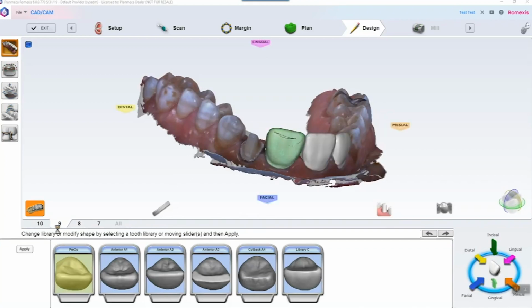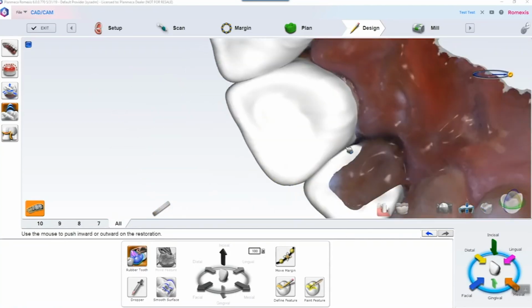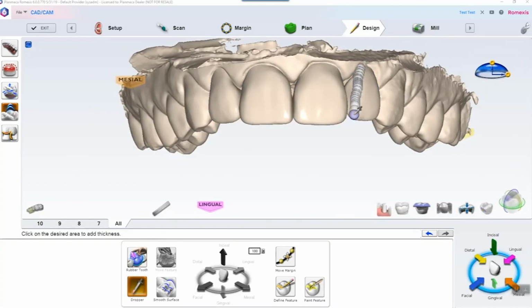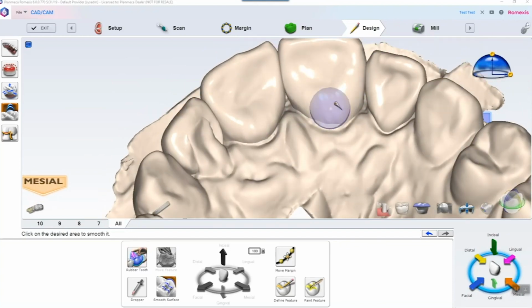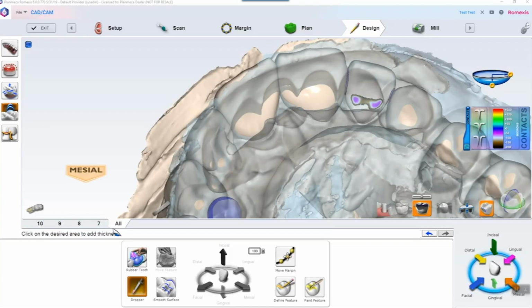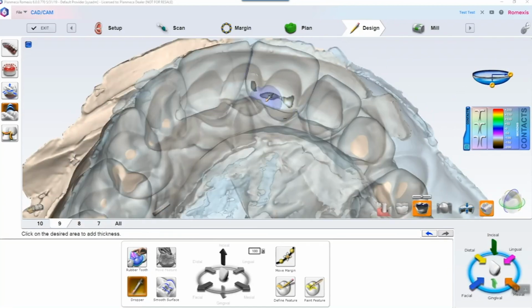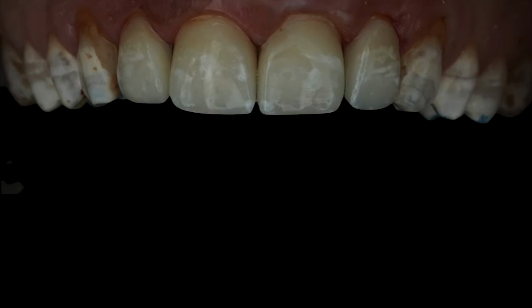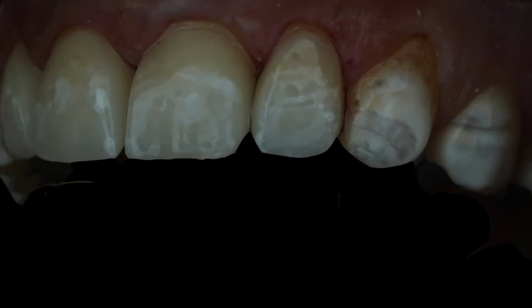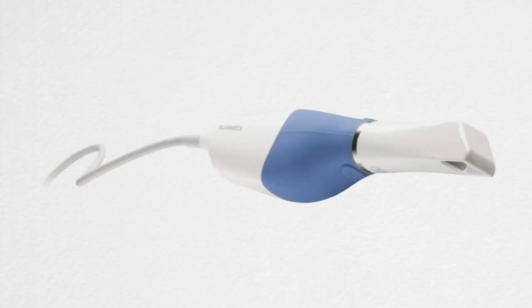And this is where he's designing the restorations. So still modifying the teeth a little bit, fixing the contacts. Maybe making them a little bit more natural looking. And then still checking some contacts to opposing teeth and to neighboring teeth as well. So here then the final restorations for the patient. So that kind of chairside CAD/CAM workflow.